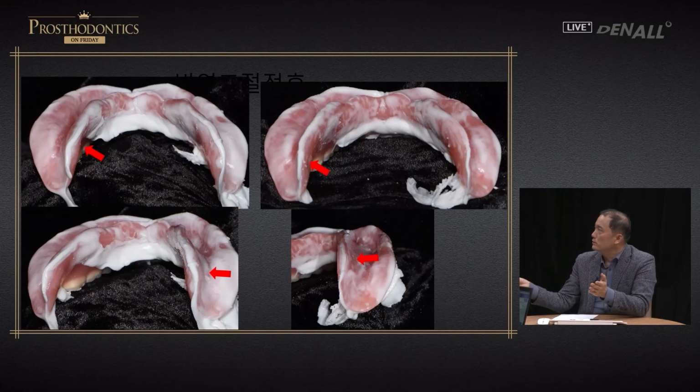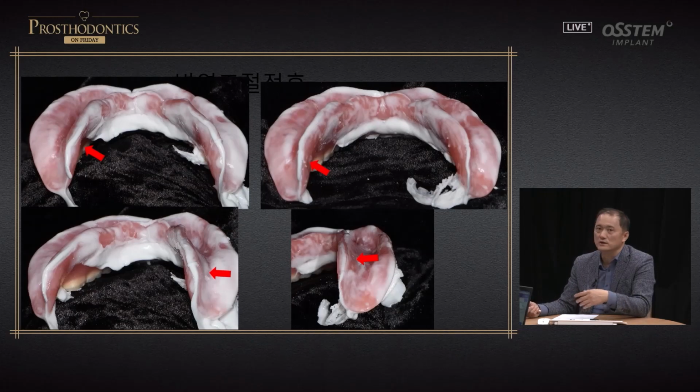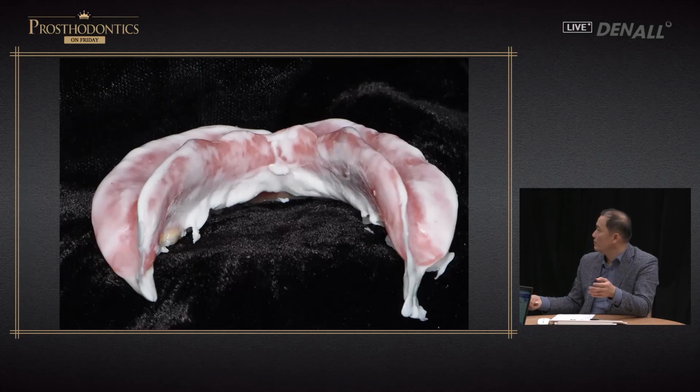So when you look at which area should be thin and which area needs to be adjusted, this is before making adjustment. Again, on these areas, tissue conditions have been marked with fit checker, and with fit checker we took the photos. If the tongue is really pushing down, there can even be holes in the check bite, so the material there has holes, and this is because of the excessive load coming from the tongue. After making adjustment in this area, you see a more consistent, regular silicone cover. Same here on the lingual side and all on the surface areas. With the tongue, the area touching the tongue, you have to make an assessment.